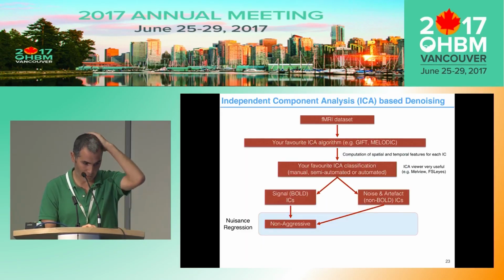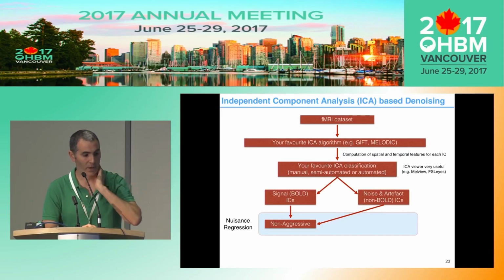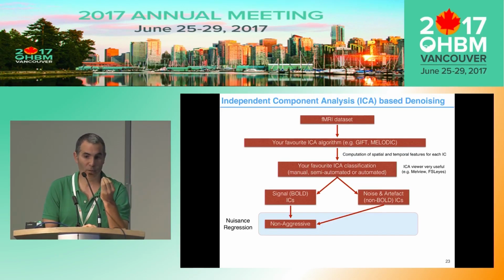Then, based on that classification, you incorporate the time courses as nuisance regressors in your model. In a non-aggressive manner, you will include all of them, like the signal and also the artifact, the time series of the signal and the artifact components.